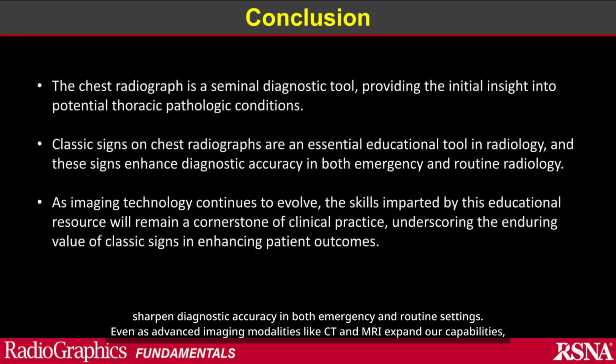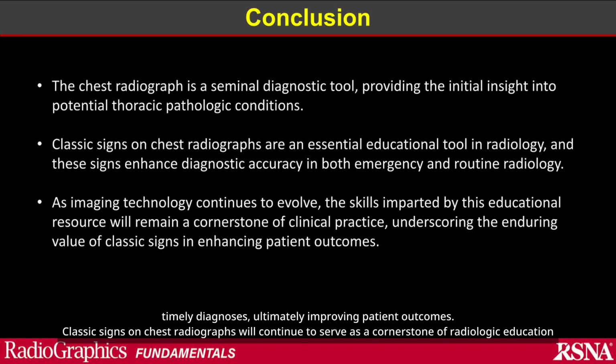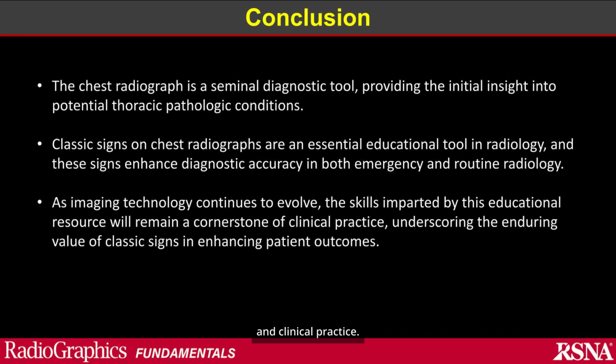Even as advanced imaging modalities like CT and MRI expand our capabilities, the knowledge of these traditional signs remains indispensable. By mastering them, radiologists and trainees alike strengthen their ability to deliver precise, timely diagnoses, ultimately improving patient outcomes. Classic signs on chest radiographs will continue to serve as a cornerstone of radiologic education and clinical practice.